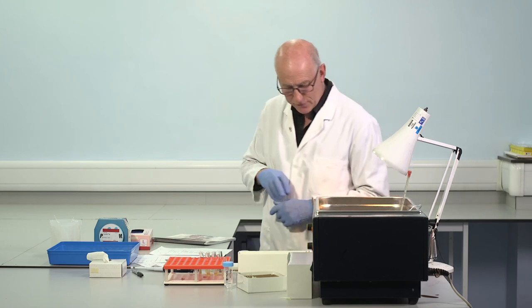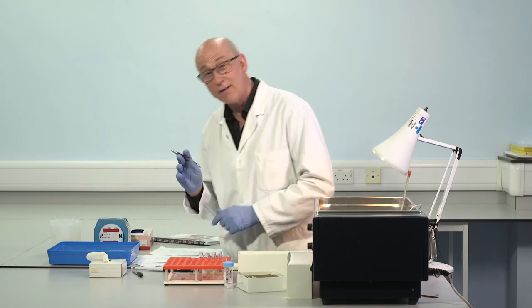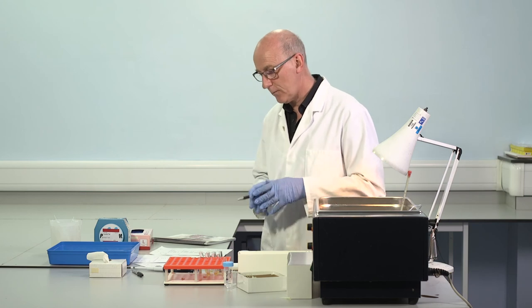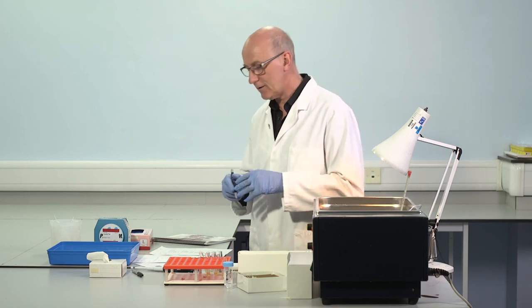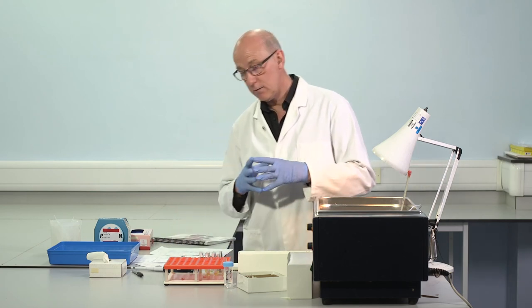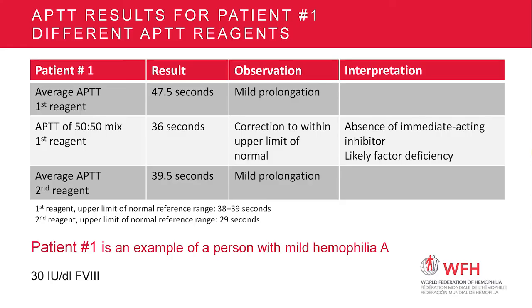Okay, so 39, 40 seconds. This is a different APTT reagent, as I mentioned. Has a different reference range. Previous reagent, upper limit of reference range 39. This has an upper limit of reference range of 29. So 39, 40 seconds, prolonged result. First reagent, 47, 48, upper limit of normal 39, prolonged result. So we've got a pretty similar degree of prolongation in both reagents.